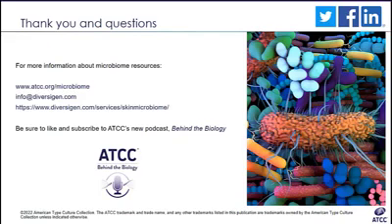But as far as the stability of it for culturing, the product format comes to you freeze-dried. So at least as far as before you start growing it, it should be stable pretty much indefinitely.